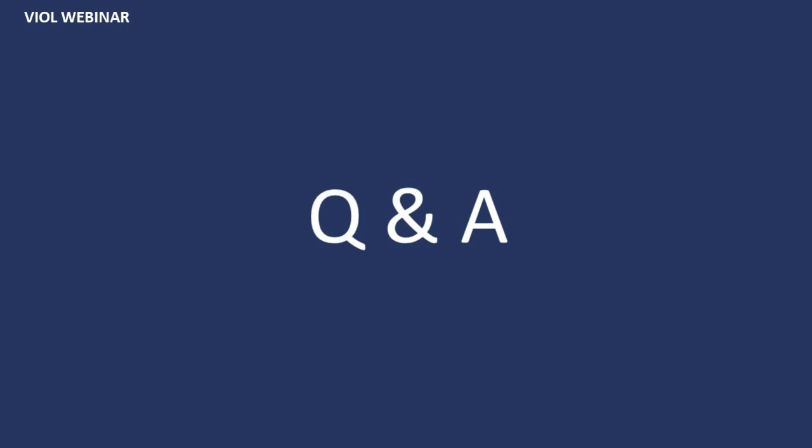One more question about acne treatment: for deep acne scars, how many sessions do you recommend? This is a great question, and every patient will be a little bit different. I view deep acne scars, which is what my son had, as you're going to get a certain percentage of improvement. Let's say we get 50% improvement with each treatment. There's an old analogy: if you're 10 feet from the wall and each step is 50%, your first step is 5 feet, your next is 2.5, then 1.25. You come as close to the wall as possible without touching it.